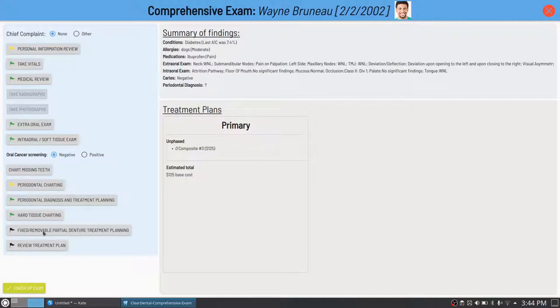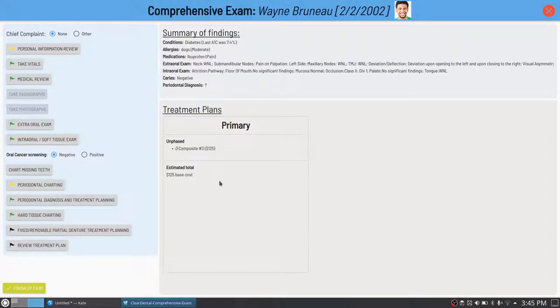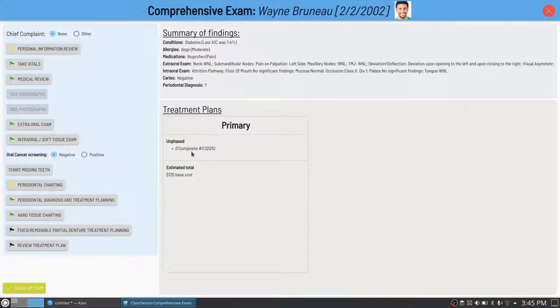If there are missing teeth, you can plan a bridge, implant, removable partial denture, or full denture depending on the situation, and there will be a dedicated UI for that. The final treatment plan review allows you to phase your treatment and set order. By default everything is unphased, but you can set periodontal treatment as phase 1, fillings as phase 2, crowns as phase 3, and re-cares as phase 4. That covers the comprehensive exam, which is not fully completed at this point.